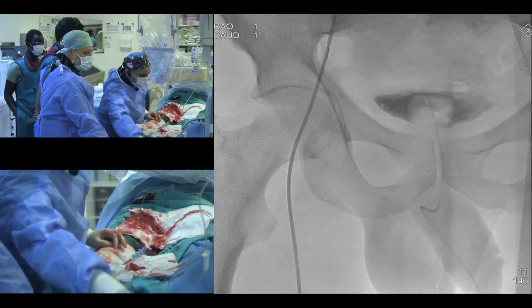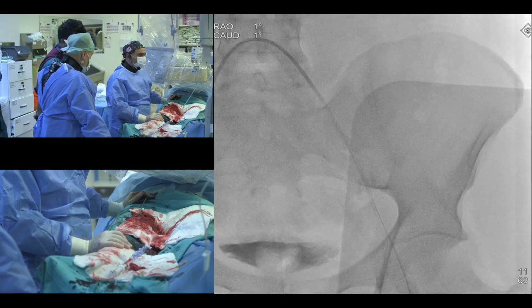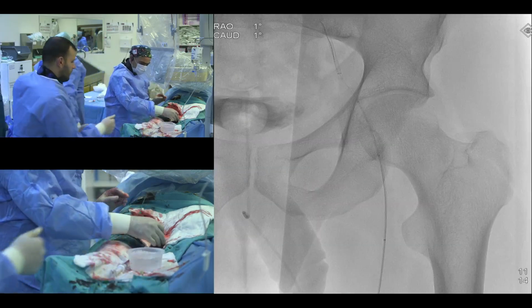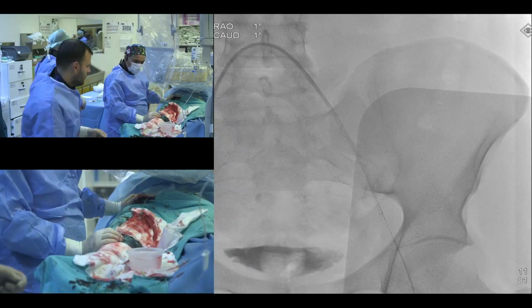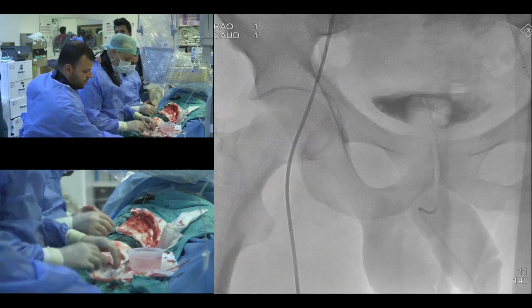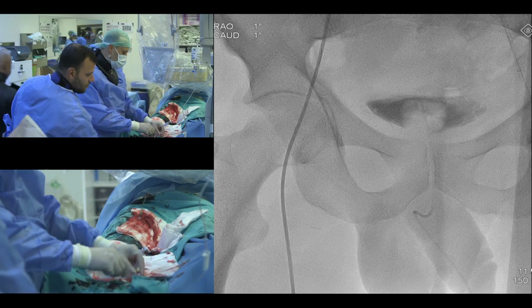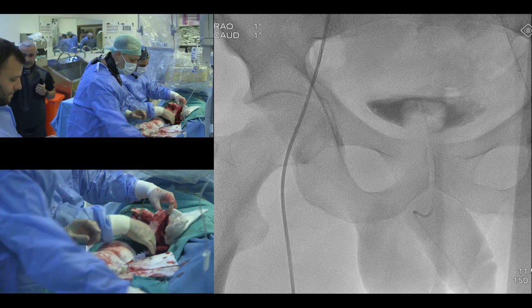Bir balon alalım şimdi. 4 ile başlayalım. 5 ile alalım. We'll have a 5 mm balloon for predilatation. Tamam, olur. Şöyle yapalım. Arkadaşlar şu suyu değiştirelim mi? Kan olmuş da. Tamam, nitrat gerekirse şu an.